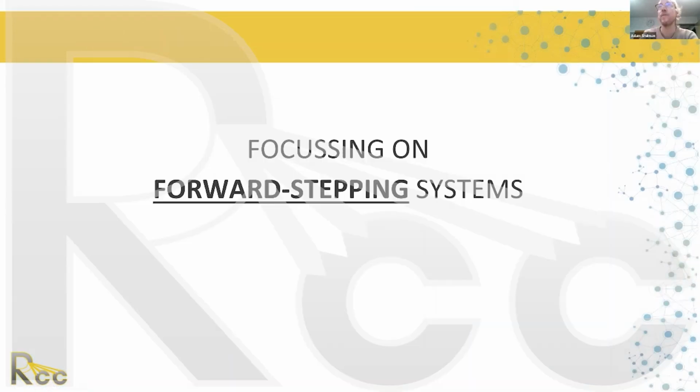So about the pitfalls, the biggest problems in it. Again, it's a complicated process. I think the biggest errors would be in going from your commissioning data, so wherever you find those dwell position differences to be, and then trying to figure out how to apply those in your TPS to make sure that they're delivered appropriately. So there are a couple somewhat confusing methods, right? You've got the dosimetry plan and delivery plan, and you've also got the extending the length. Then you've got those initial first few millimeters to 5 millimeters or 6 millimeters or so, whatever you determine during commissioning, where you can't use those dwell positions at the very tip.